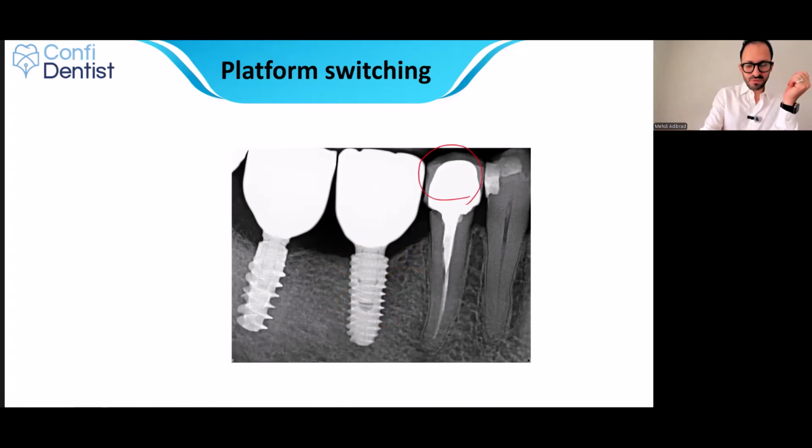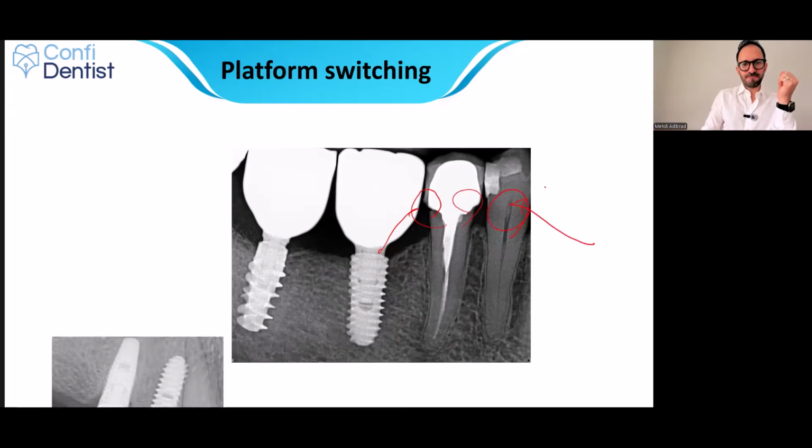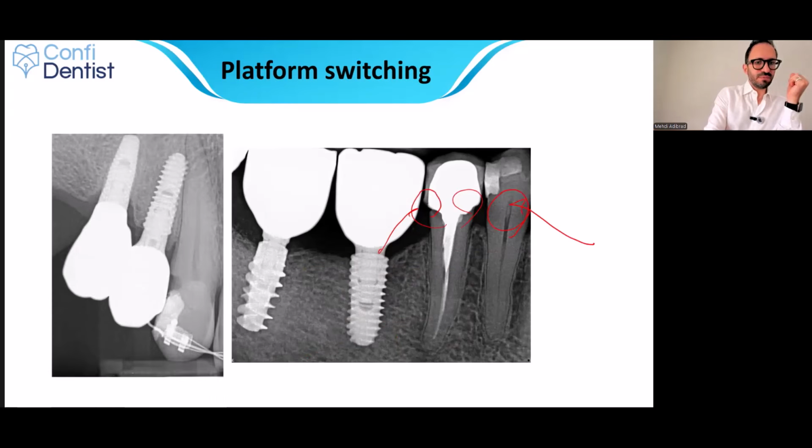You can see a PFM crown, the post. The root canal has a little bit low density, maybe a little bit underfilled. Some evidence of calcification, composite restoration. Okay. Defective restoration, defective crown, margin is open. Okay. And some evidence of pulpal calcification. Okay. Another example.